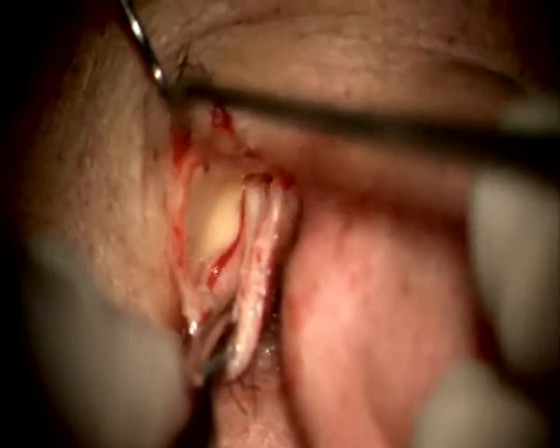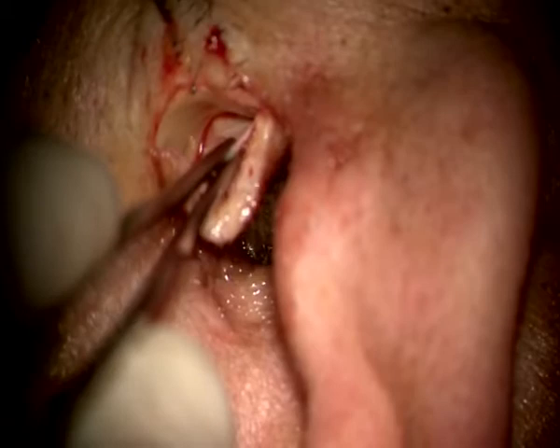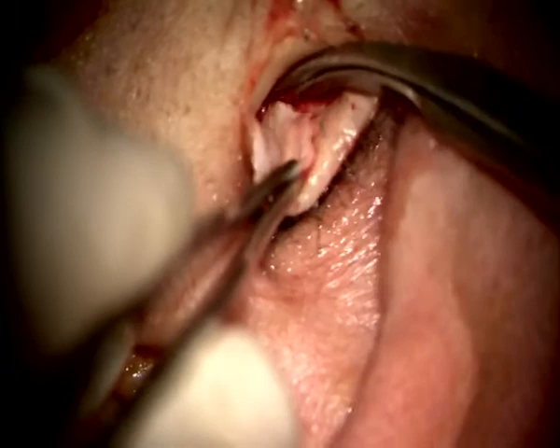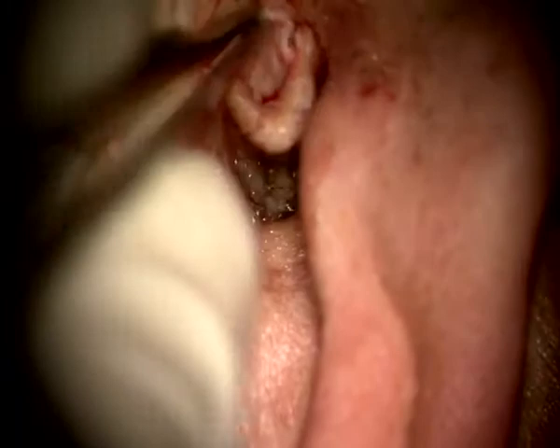Give me a scissors, please. So again, cut as far as you can. Here, cut that area of the button. And superiorly is where you get most of your graft.